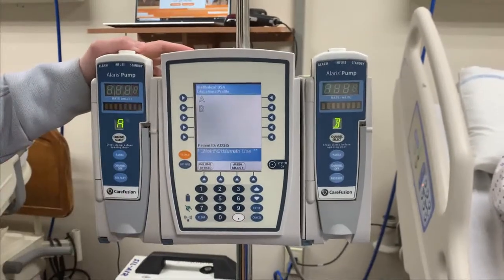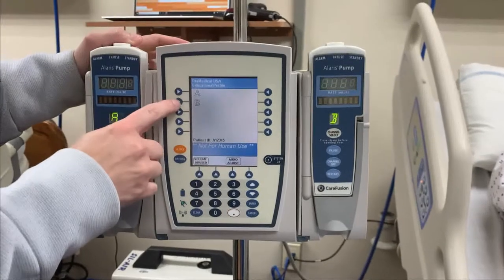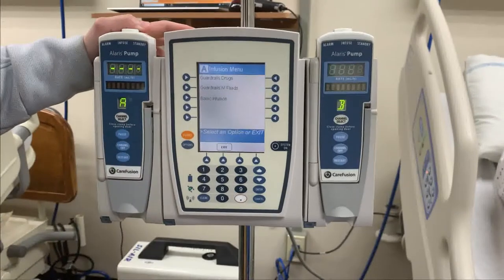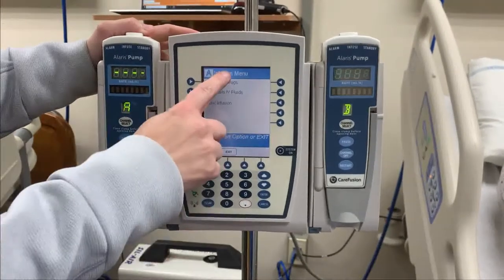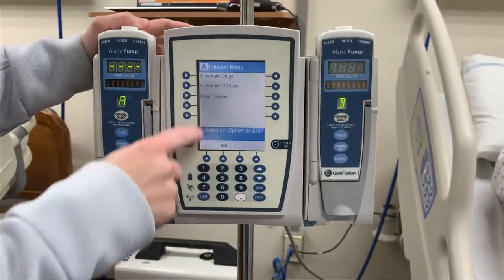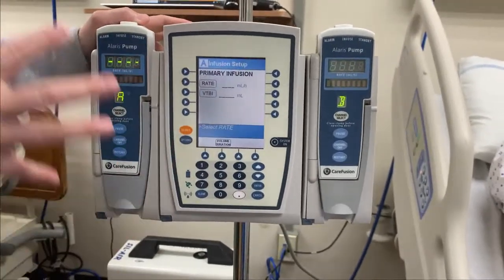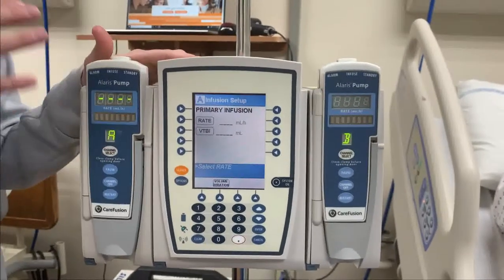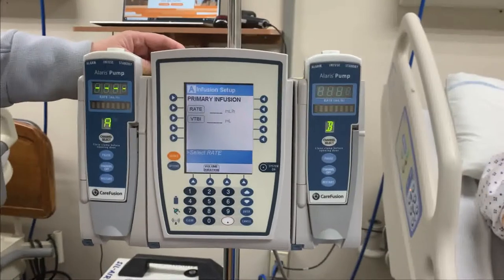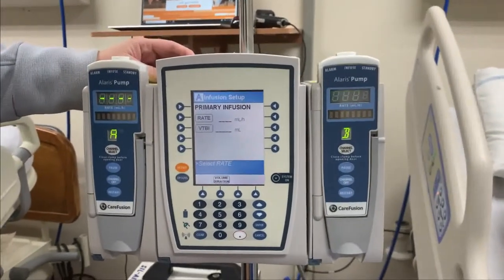Now it's going to ask me which channel I want to use. It says we have channel A and channel B. I'm going to hit channel select on my A pump, and now it brings up options. So what am I going to be doing today? I'm going to do a basic infusion. If you're in doubt of what to pick, you can always select basic infusion — it's going to give you the two things you need to set: a rate and how much fluid is going to go into your patient.